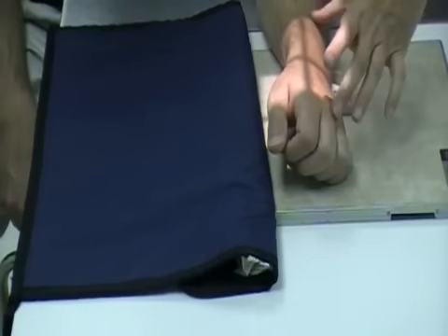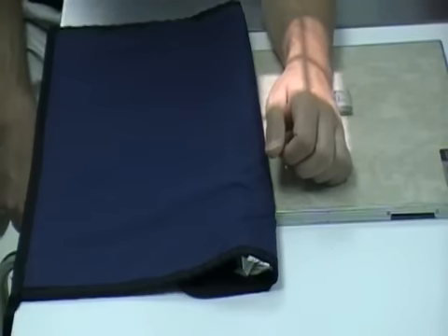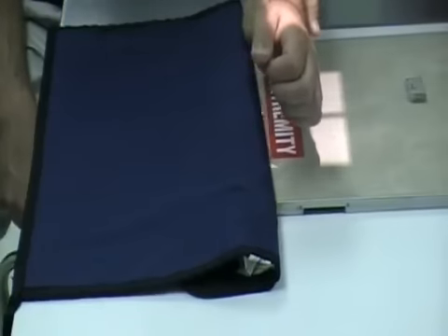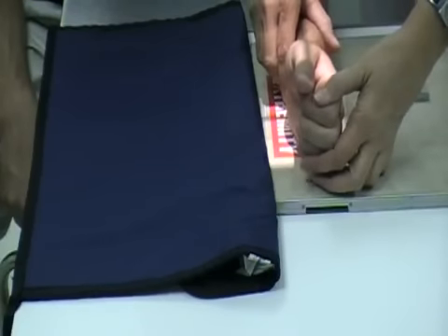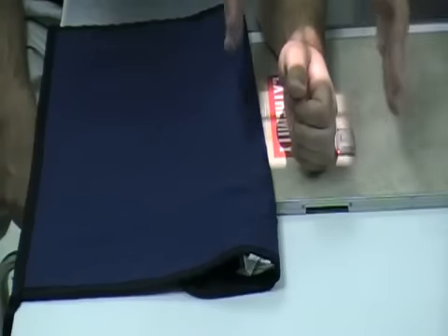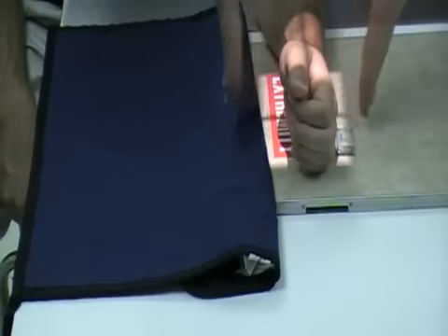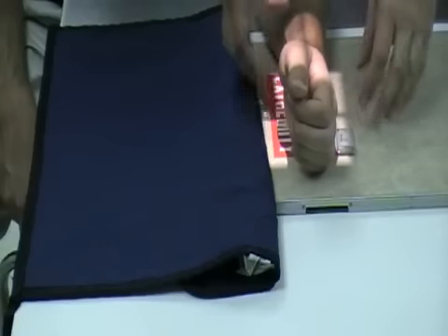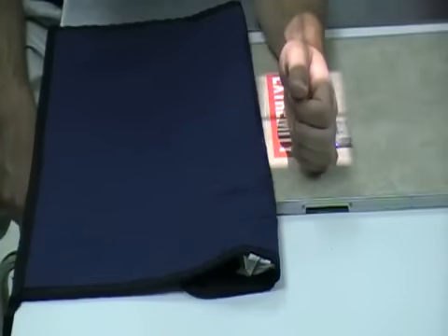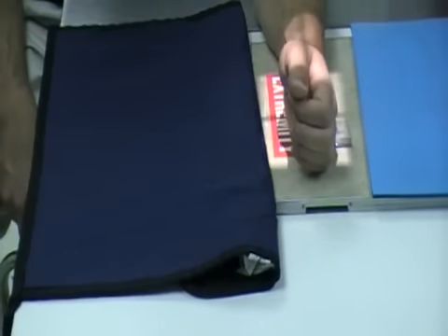Check your collimation — we do have it open — and then we're ready for the oblique exposure. After that we would go on to the lateral, and bring the hand up all the way on its side. Check to make sure you do have a shadow anteriorly and posteriorly of the hand, because if it's in too tight, you'll be cutting off a portion of that. So that is our lateral wrist.